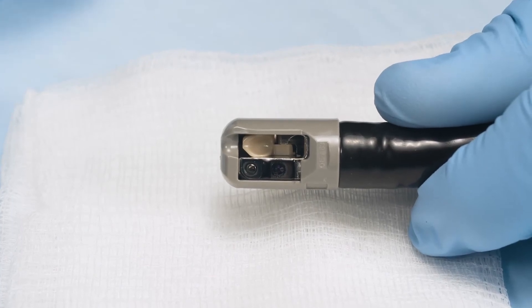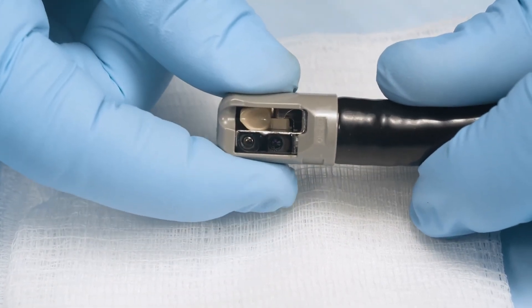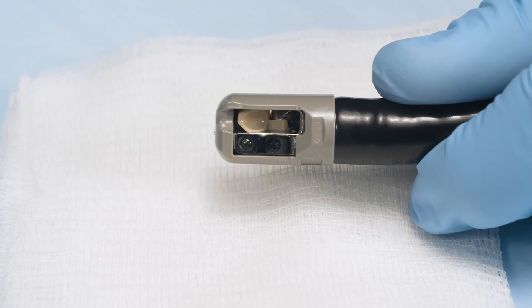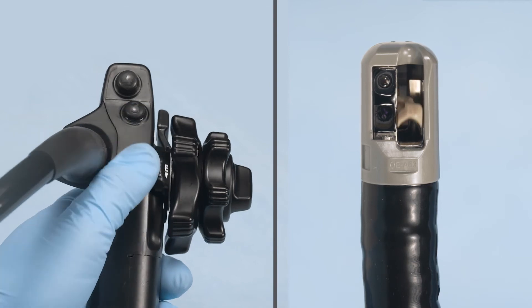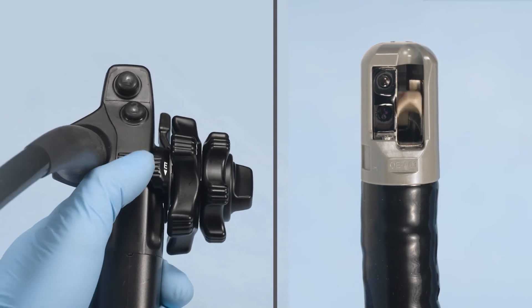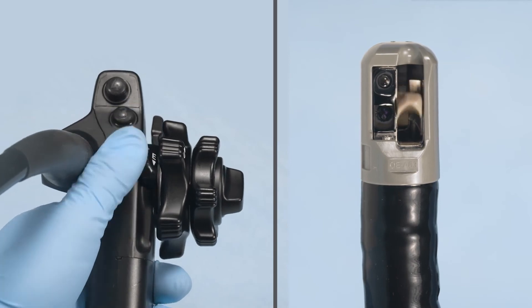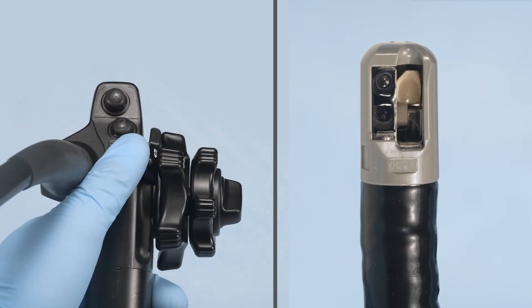Lightly push on the area where the model name appears with your finger. Grasp the end of the distal end cap and gently pull to ensure that it does not come off. Lastly, check that the elevator can be raised and lowered according to the operation of the elevator control lever. Move the elevator control lever slowly two or three times in each direction and ensure that the elevator part of the distal end cap operates smoothly.